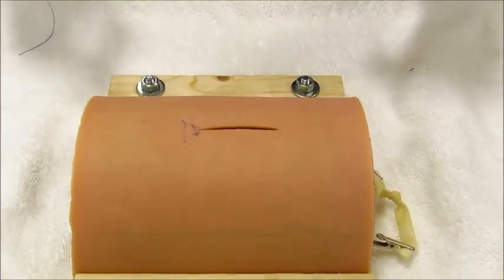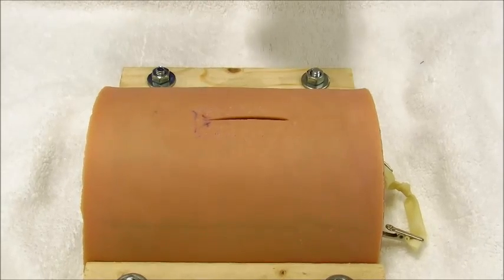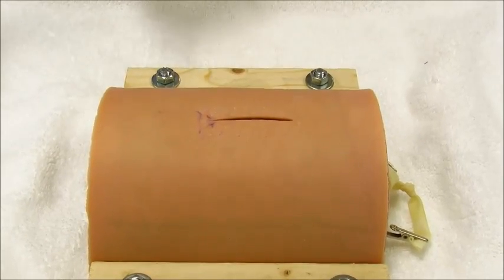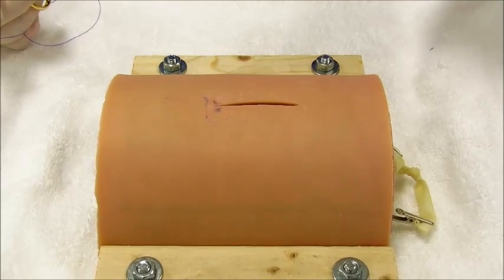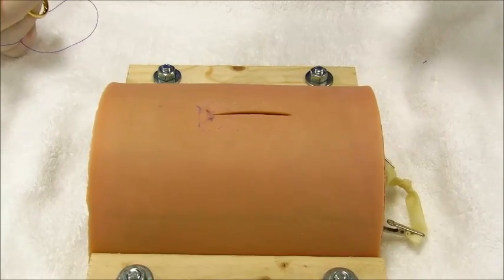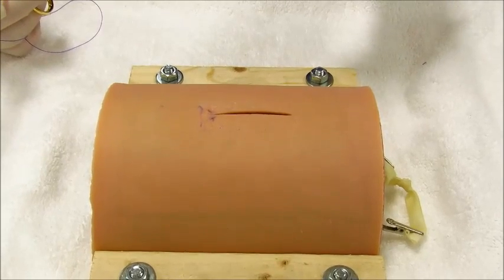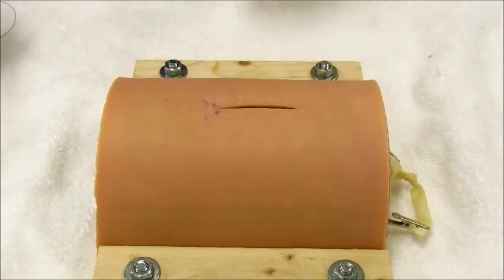The most common inverting suture pattern that you're going to use by far in practice is the Cushing pattern. There's a sister pattern to that called the Connell pattern, which is the same pattern, it just goes into the lumen, which is rarely performed. So for the most part, you're only going to be performing a Cushing pattern, which is what we're going to show you today.